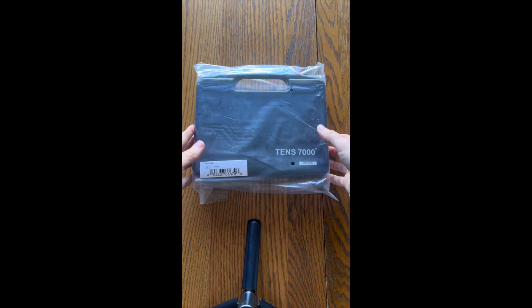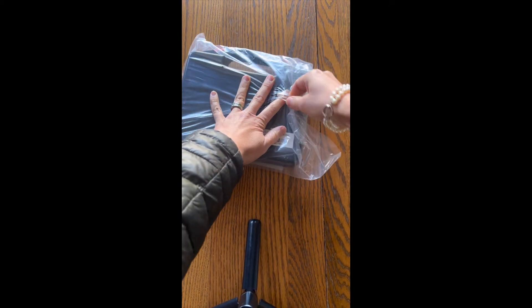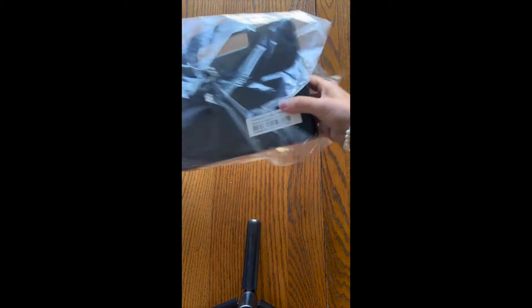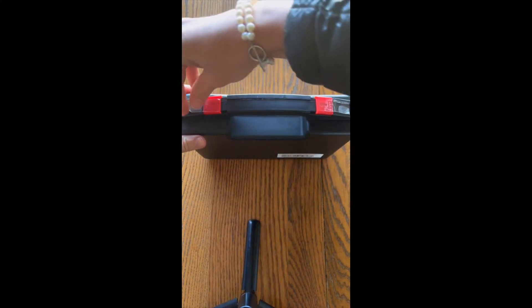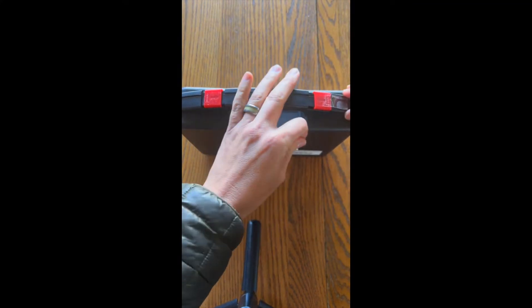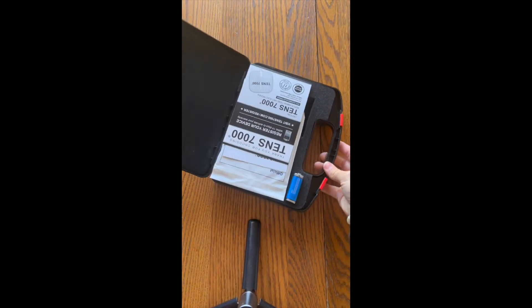Congrats on your new TENS unit. To start with, if the unit is wrapped in plastic, you will take it out of the plastic and if there are any small pieces of tape around the edges, you'll have to undo the tape. Now we can open up the unit and see what's inside.